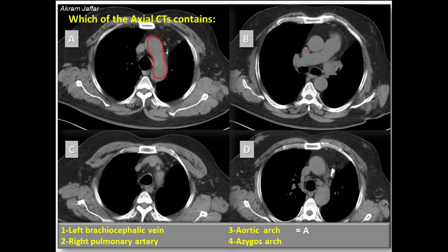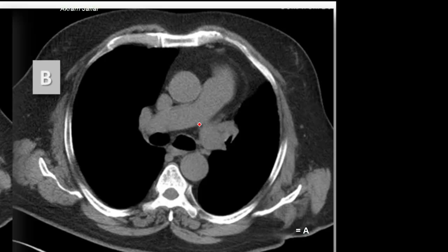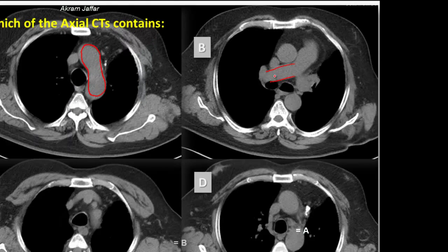Now let's look at B. Of the structures that we can see here in B is the ascending aorta, the descending aorta, the superior vena cava, the pulmonary trunk, the right pulmonary artery, and left pulmonary artery. So the right pulmonary artery matches with B.